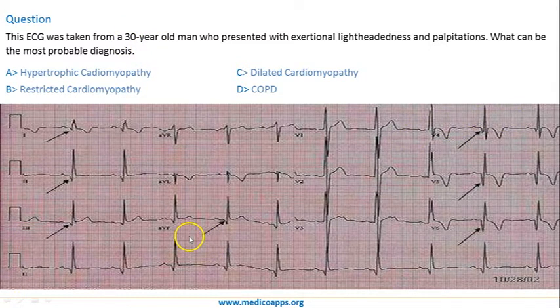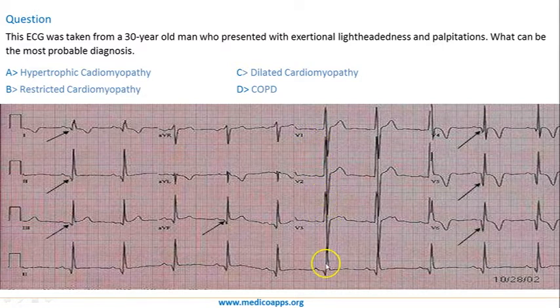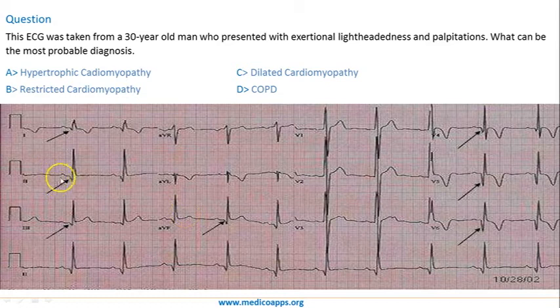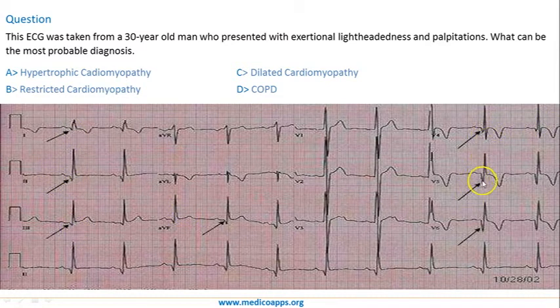The first characteristic finding we can see is very high voltage QRS complexes — it's almost difficult to ignore. The second thing you see is the Q waves. In each of the ECG leads, if you see these Q waves, they are almost what you can describe as dagger-like.